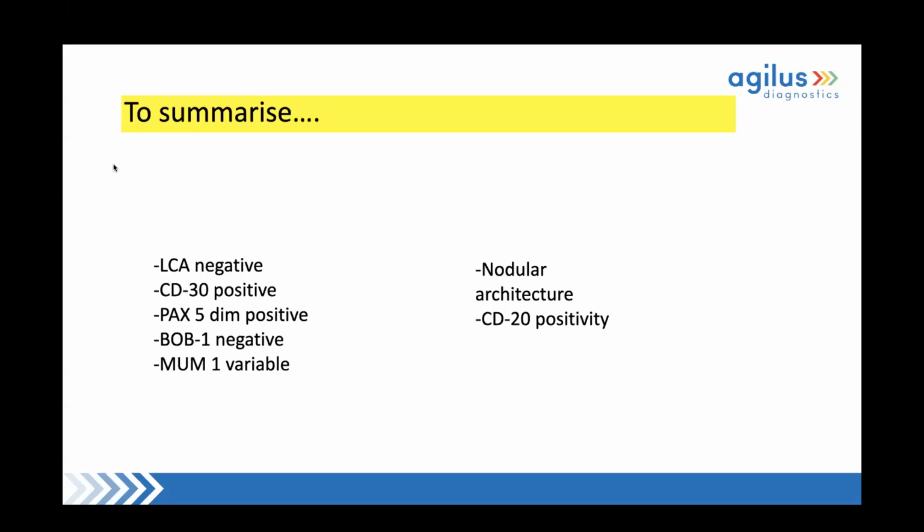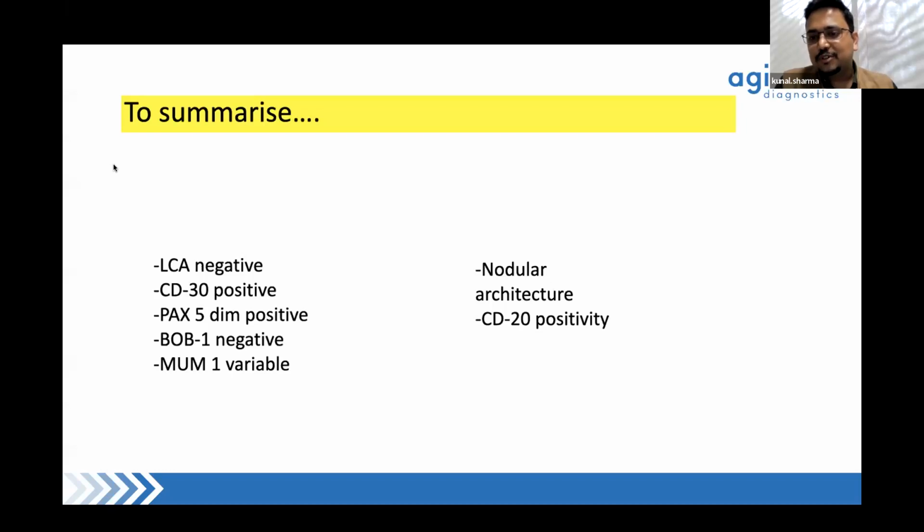I'll just come in now because we can go on discussing this. GATA3 shows positivity in a lot of other cases, including PTCL, where we now subtype PTCLs based on GATA3 positivity. Hodgkin's and T-cell lymphomas can sometimes be confusing, including CD30 positivity seen in PTCLs. Our main purpose here was to differentiate classical Hodgkin's from NLPHL. So GATA3 wouldn't really have helped in the panel. I think that's why none of us really bothered.